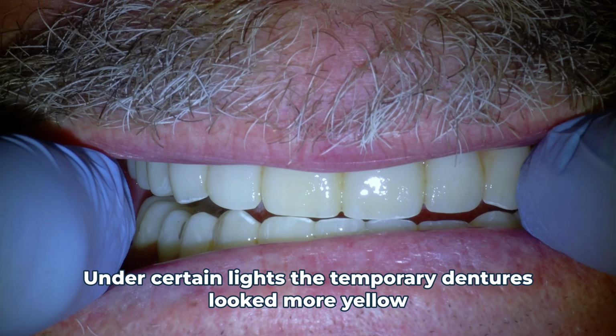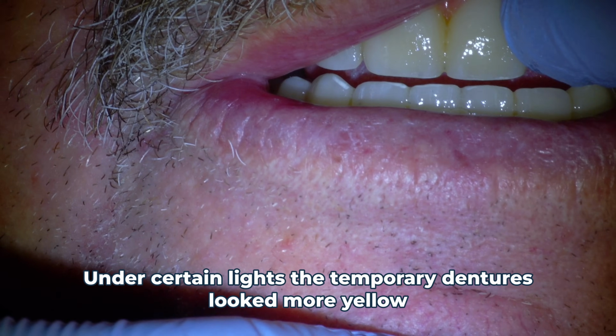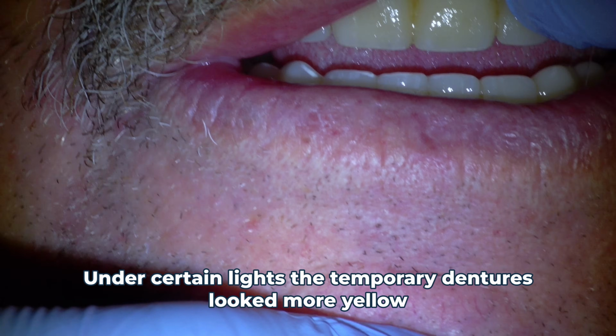Now, as part of the process, as things are healing over the next few months, we want the patient to make note of many things. How they function with eating and speaking, also how the jaw feels, and what they like or don't like about the cosmetics, including the shade of the teeth. Our patient loves the way they feel and look, but wants them to be a lighter shade than he originally chose.